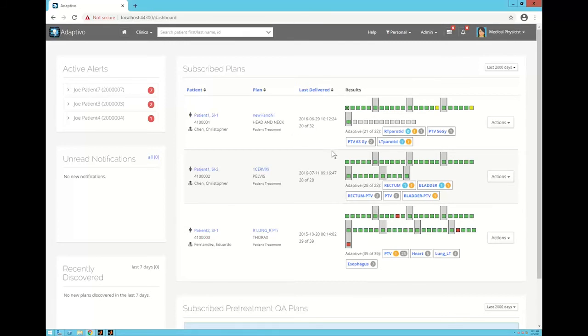So you can see here the regions of interest that are having notifications, as well as from the cone beam CT and associated 3D dose computations, as well as the in vivo related measured versus predicted portal doses versus the reference fraction.